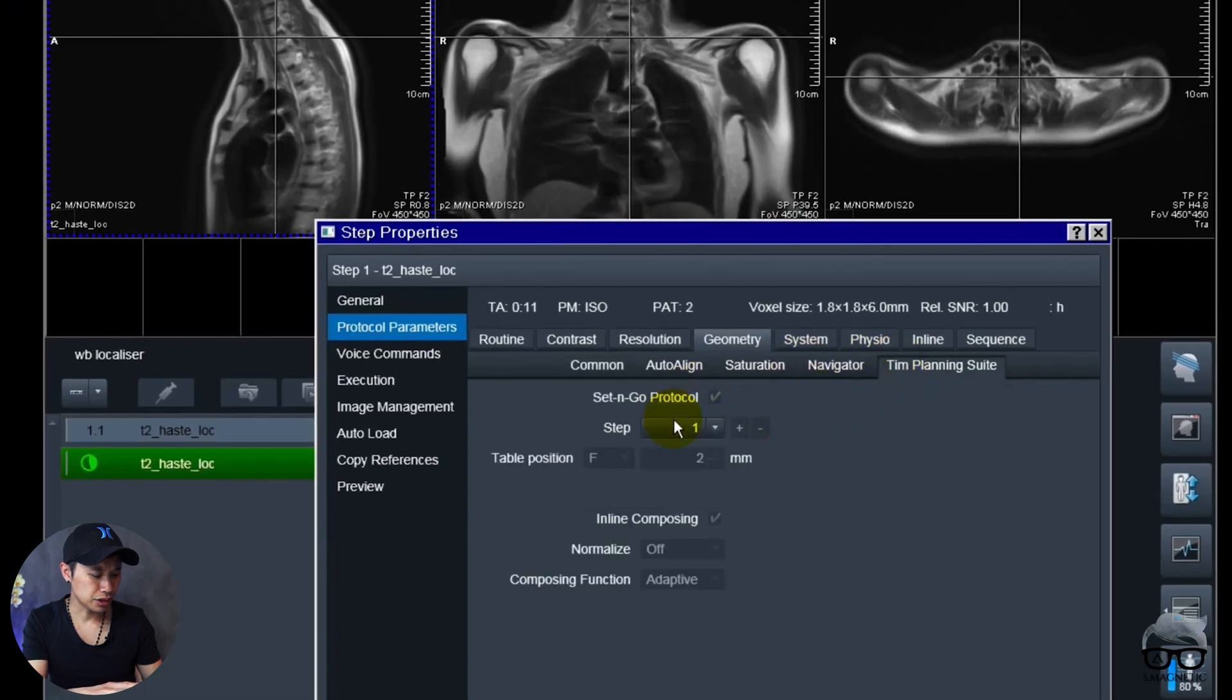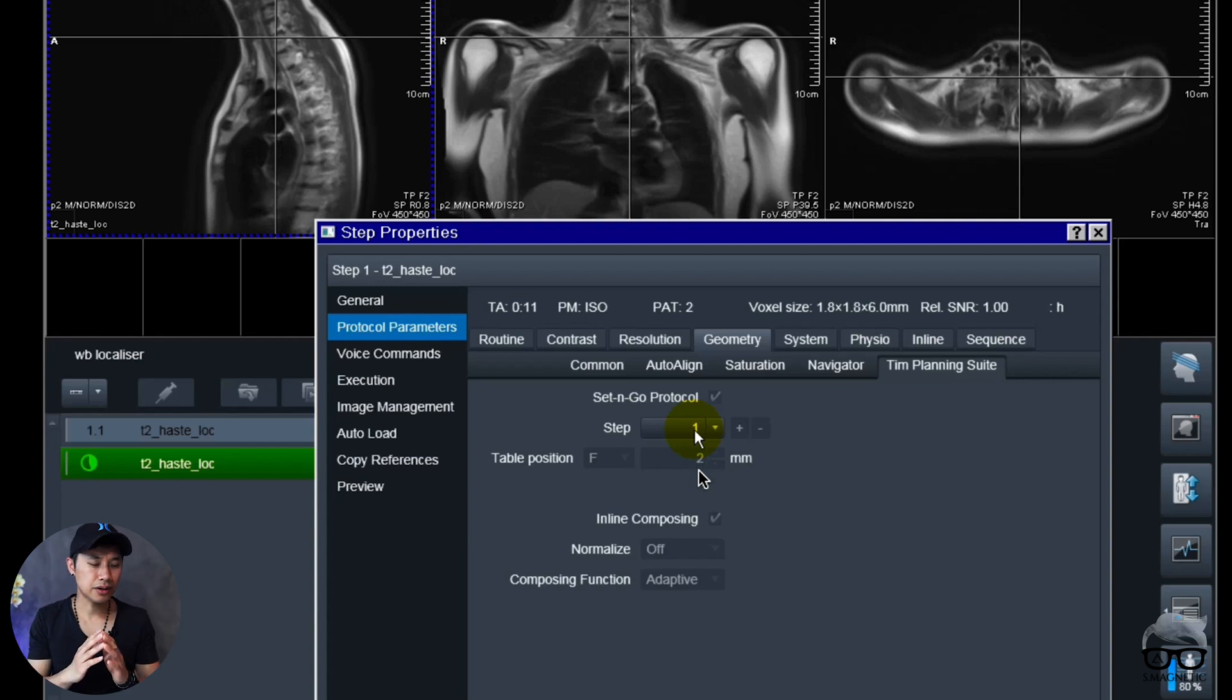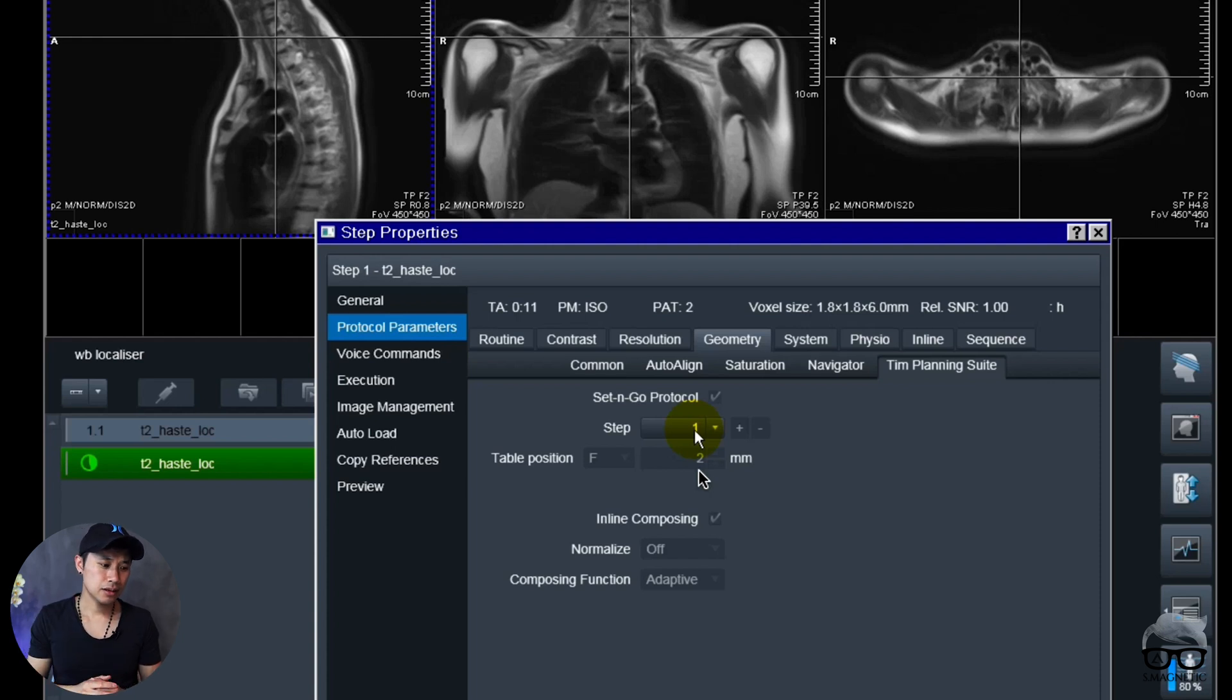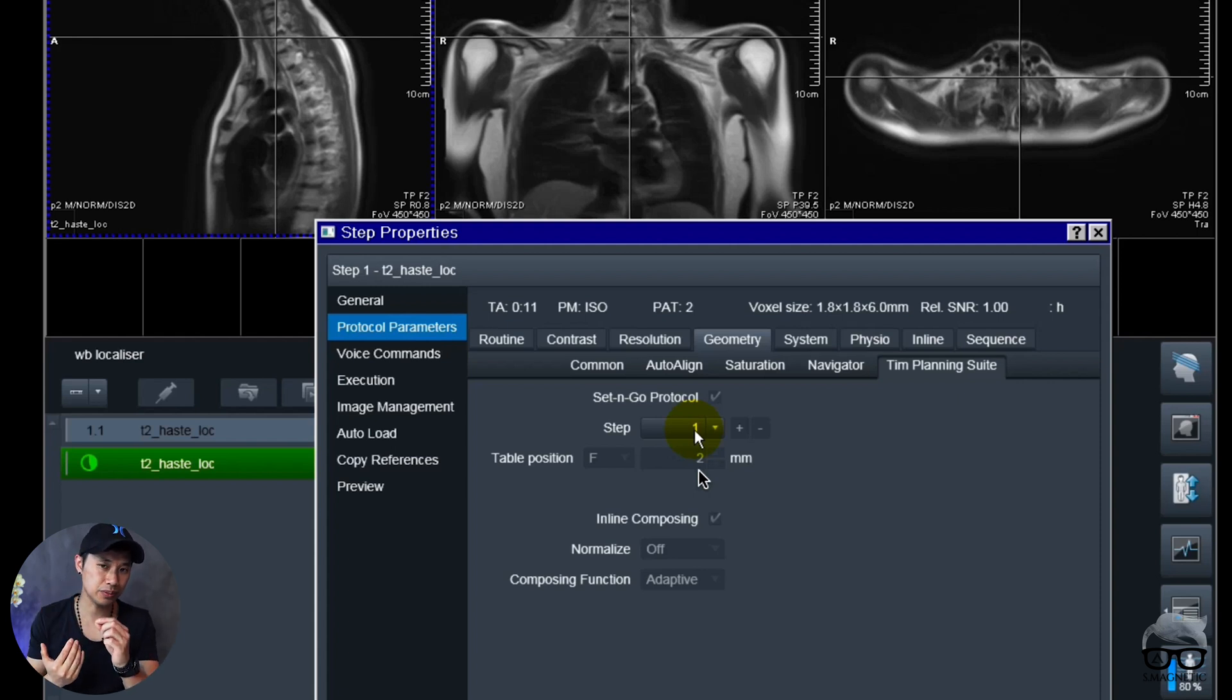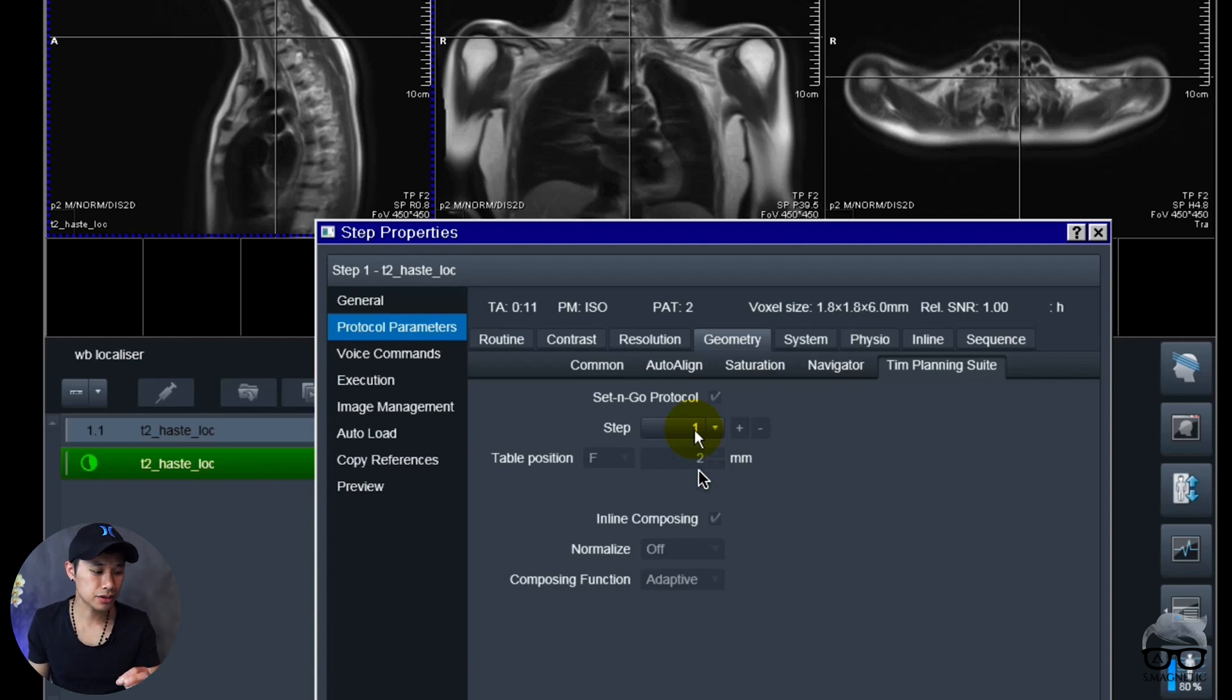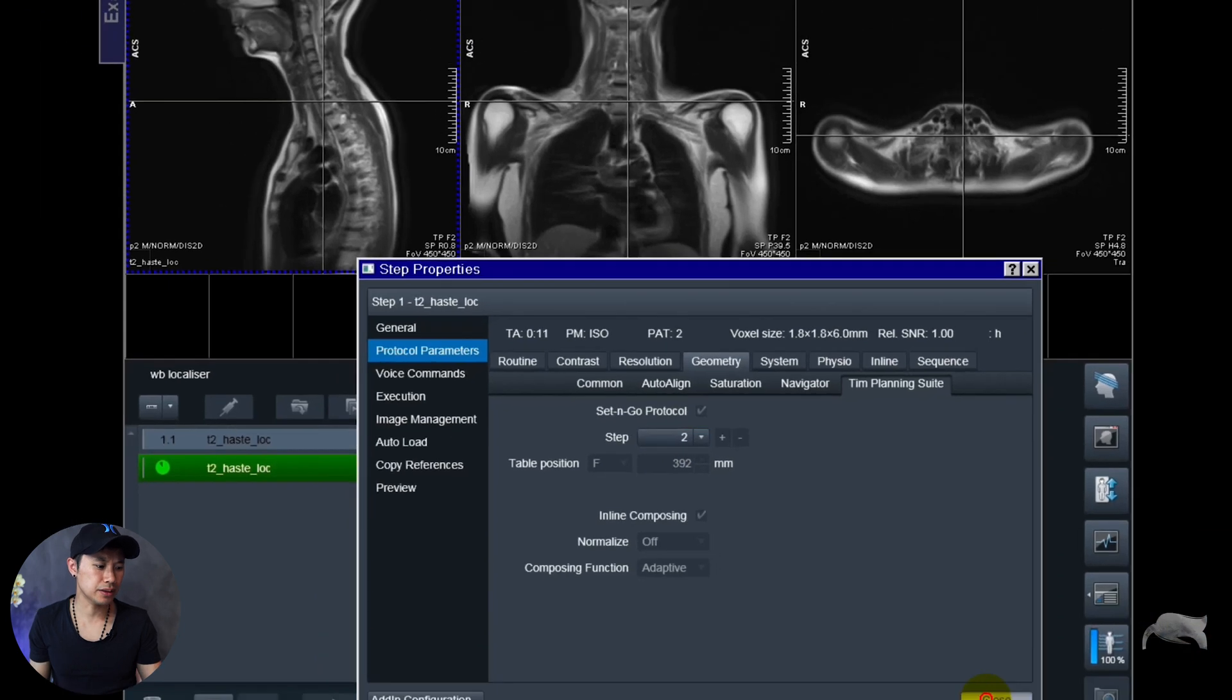I just want to show you one thing. So we are in the first step right now and I'm going to show you the position. You see the table position is F2. So if you want to have it perfectly, you want to have it zero. So that means that whenever you position the isocenter, the red light inside the scanner, it will start right there. So this means I saved it F2 millimeter, that means that it will go towards the feet two millimeters. So I wish I had zero but I didn't notice that when I made this video.